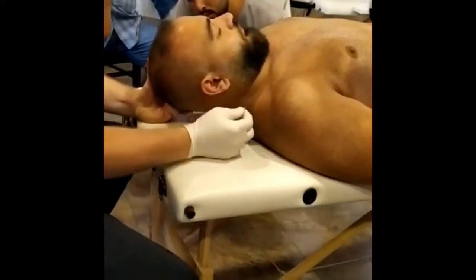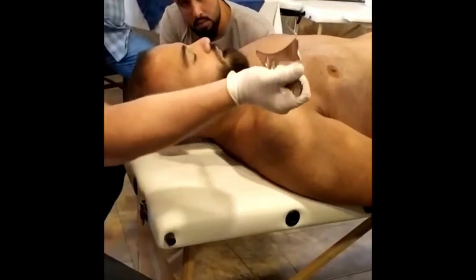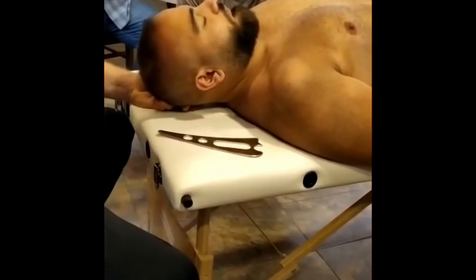What I'm doing is I'm going to engage up, rotate it slightly, and pull back towards the number — so up, rotate this way, getting right into the back of that suboccipital.